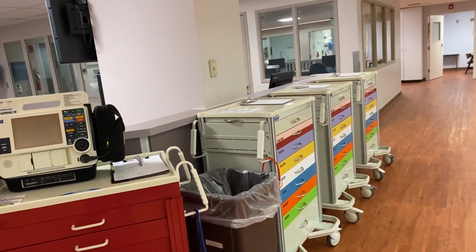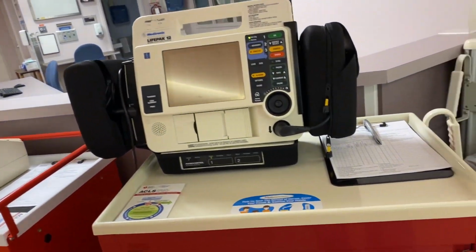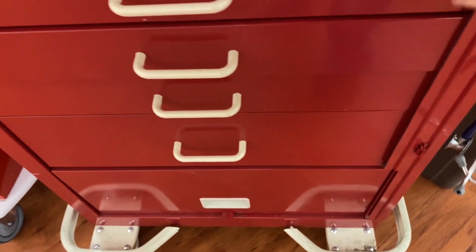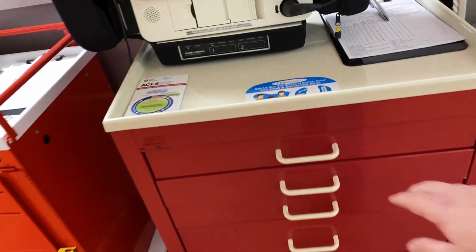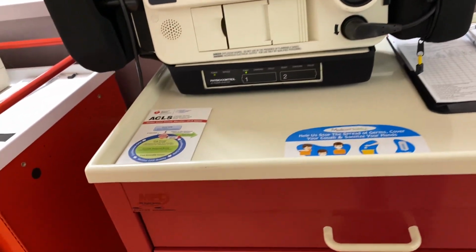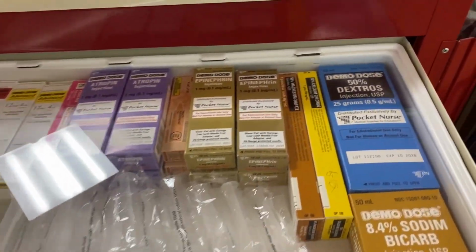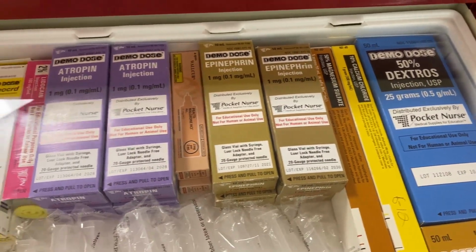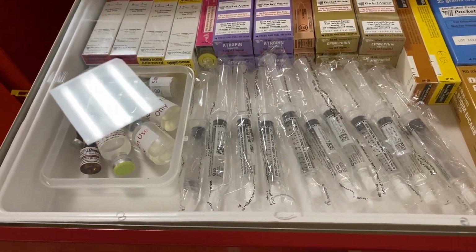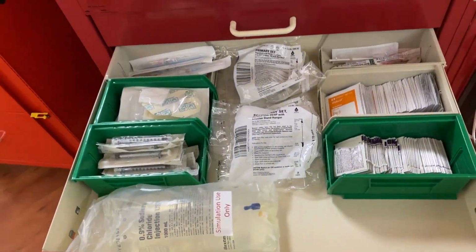I did go ahead and show you the inside of one of the crash carts. We do keep those locked, and the defibrillators are marked as for simulation use only. They are maintained by the hospital's biomed department, which the stickers are on the back. I didn't actually show that. I apologize. There's a crash cart code chart paper. Of course, we use all demo dose medications, no real medications, and try to keep it as organized as possible. We do a lot of ACLS classes, so these things get ransacked quite a bit, and so we're constantly having to have the instructors redo all of this.